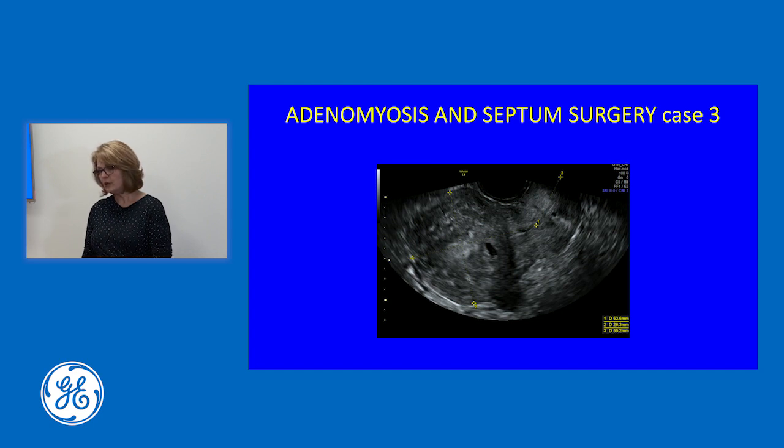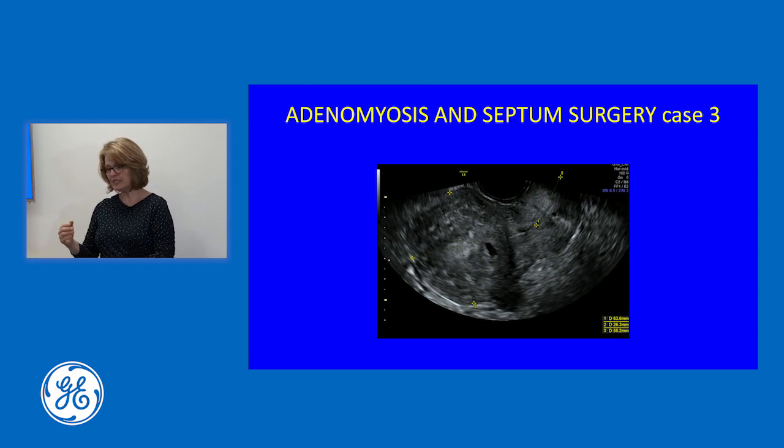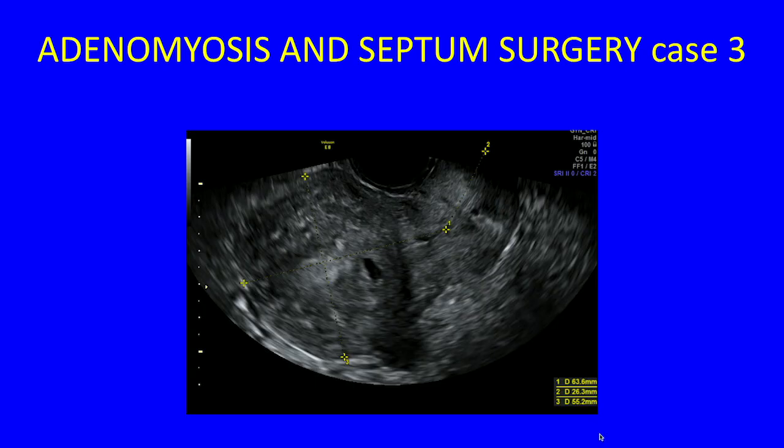Women who have a congenitally abnormal uterus often have a degree of obstruction, as I said to you earlier. It may be at the point, if they have a subseptate uterus or a septate uterus, where the septum is close to the cervix, those spaces are often very tight, or it might be the external cervical os, or it might be anywhere. So when they menstruate, they can have more retrograde menstruation than other people, and they seem to be more susceptible to adenomyosis and endometriosis. And this is going to be one of these cases. This lady had a bulky uterus.